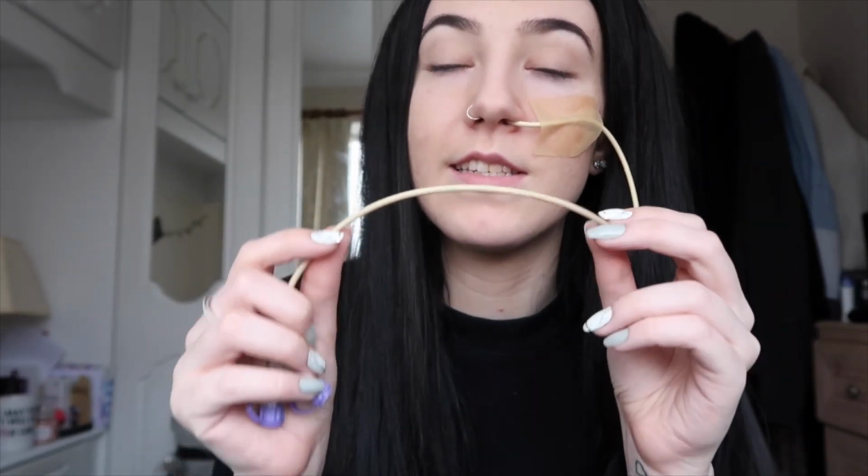Now when I'm talking about 8 French, 10 French, I'm talking about the size of the tube, so the thickness. So this is an NJ and this is an 8 French. So ideally you want a 10 French, which is a little bit bigger and better to drain with, but like I said, my company doesn't supply those tubes, so we have 8 Frenches. So that's what I'm going to be using today.